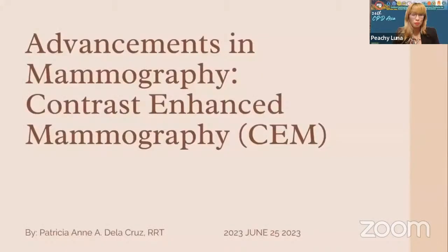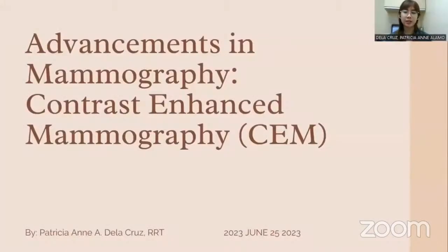So good day to everyone. I am Patricia Ann A. de la Cruz, registered radiologic technologist here in the Philippines. So now I'm going to discuss advancements in mammography, particularly contrast-enhanced mammography or the CEM.